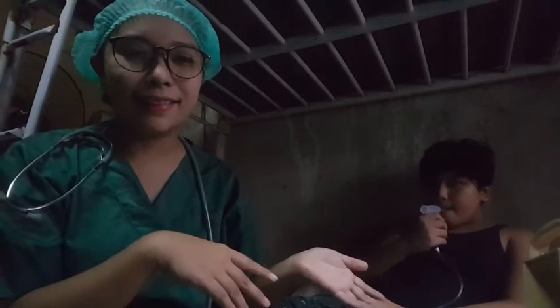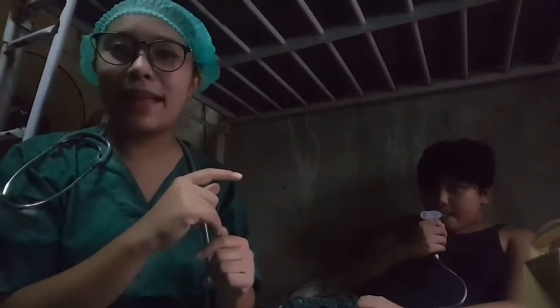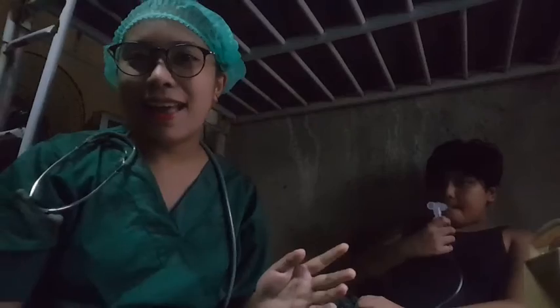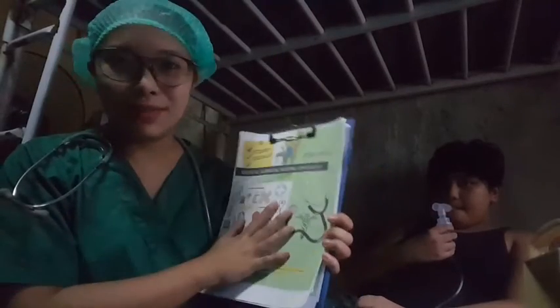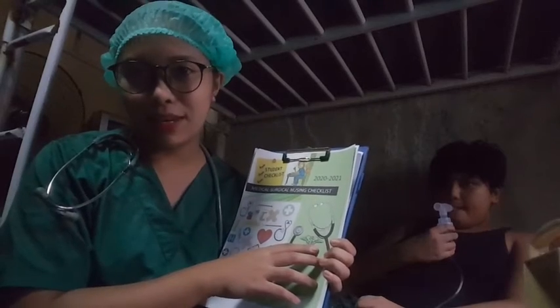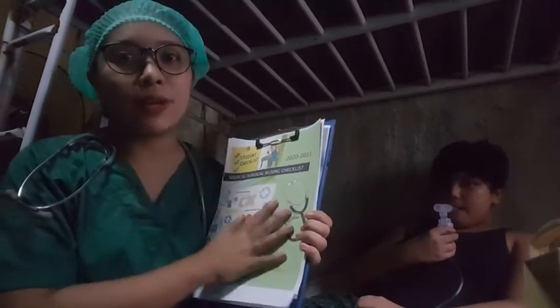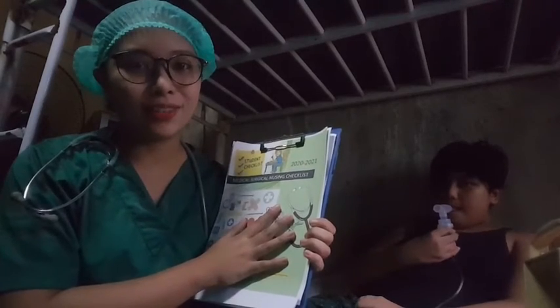Now, once we are done, we remove the gloves and additional PPE if used and perform hand hygiene. Document the medication administration immediately after giving the medication, and evaluate the patient's response to the medication, with appropriate time to reassess lung sounds, oxygen saturation if ordered, and respirations.